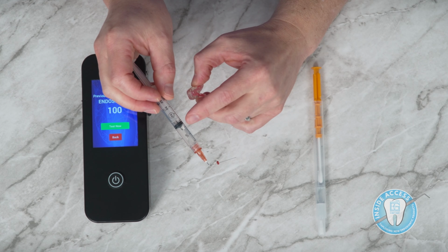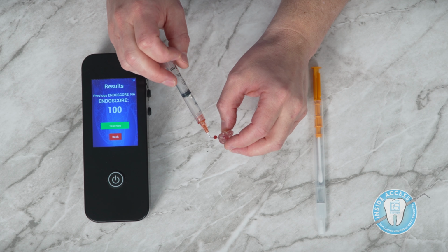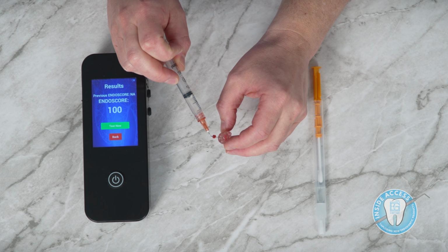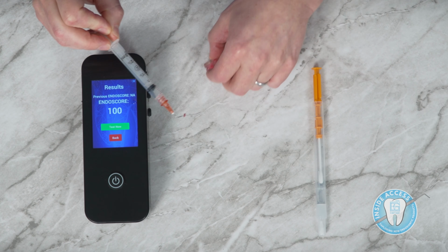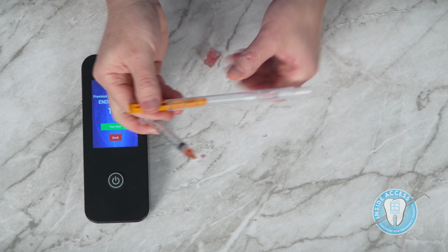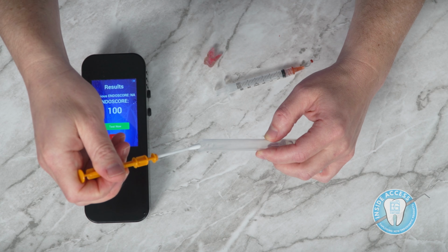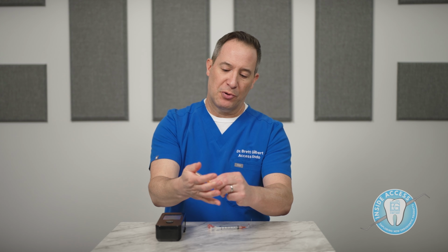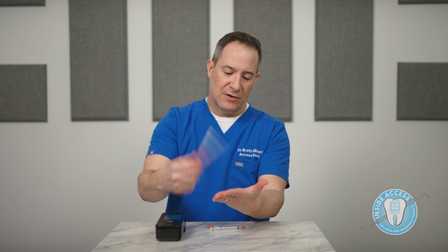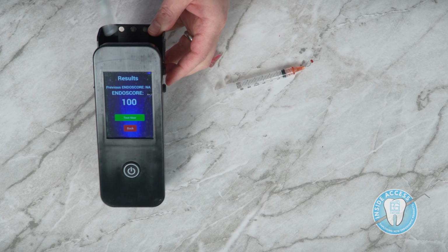The way that's done is using just a little bit of distilled water. I've got the VIP irrigating tip, the Voyager tip from Vista here. You would basically just put some solution into the chamber like so. Then you would aspirate that solution back out. This allows you to collect enough solution to put just a few drops inside the tube here. So we drop a few drops inside the tube. That's all that's necessary. The key element is to make sure that the swab collects that material on its way down. You push it all the way in, give it a good bang here on your finger, a little agitation like so, and then place it right into the Endocator.